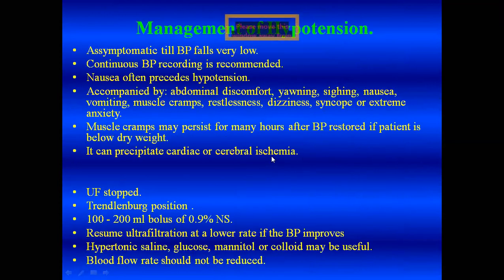How do we manage hypotension? Unfortunately, one of the early signs of impending hypotension, in addition to muscle cramps, is that the patients start increasingly yawning during the dialysis session. And many nurses will notice that a patient who is yawning more is likely to get hypotension and stop the ultrafiltration even at that point of time.